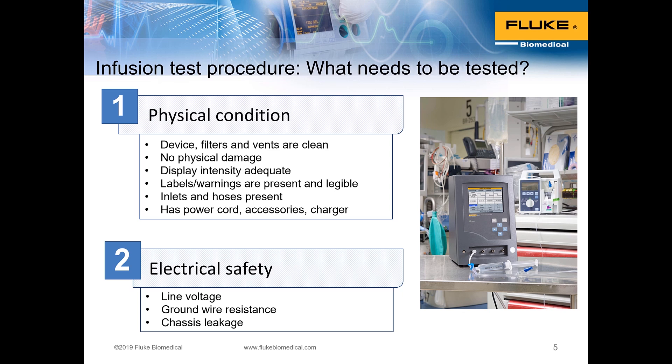When we test, in order to ensure proper performance for safe and effective clinical use, we look at the physical condition of the infusion device — filters, vents are clean, physical damage, display intensity, labels and warnings present and legible. We'll also be doing electrical safety testing even if the infusion device is battery powered — electrical safety class IP, internal power — and we need to perform a leakage current measurement test, called touch current, at minimum.